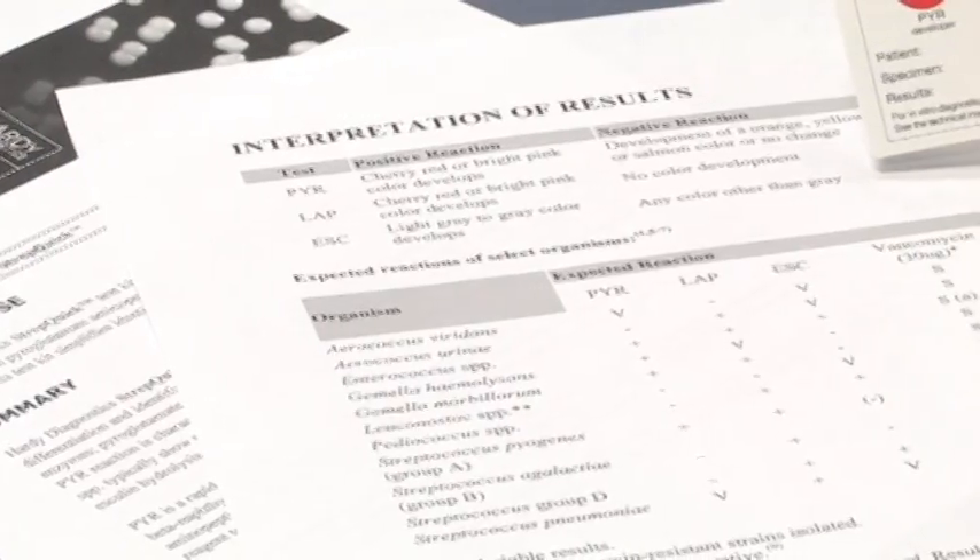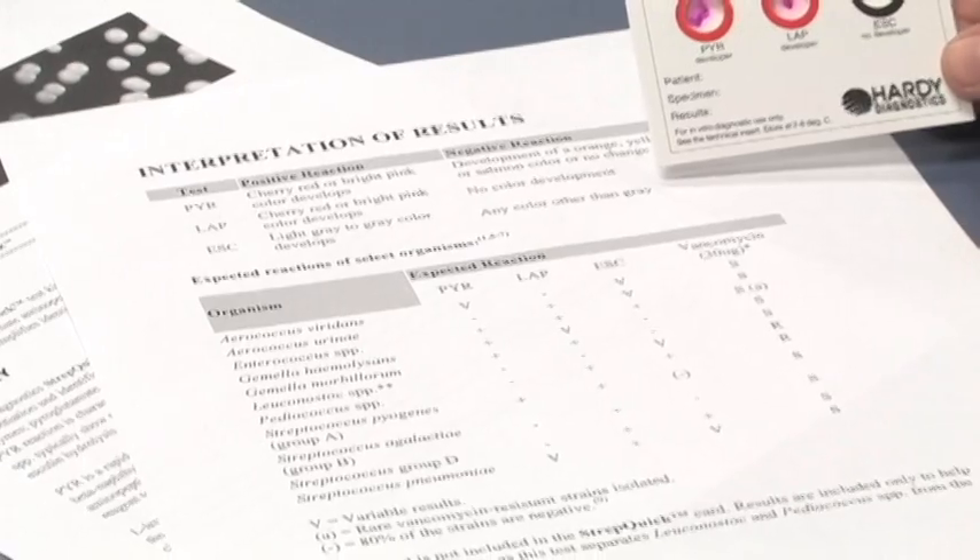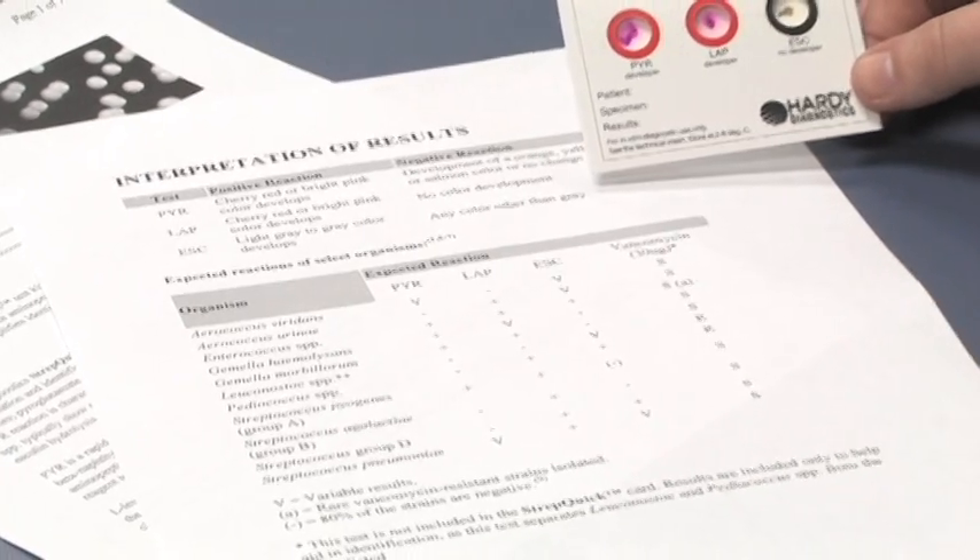After you record your results, look at the identification chart provided with the kit and match up your test results.